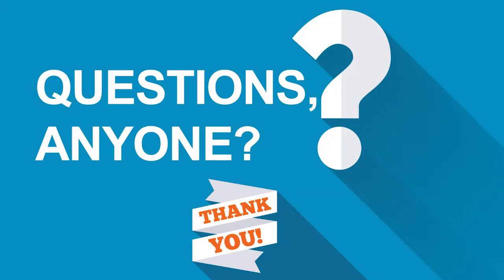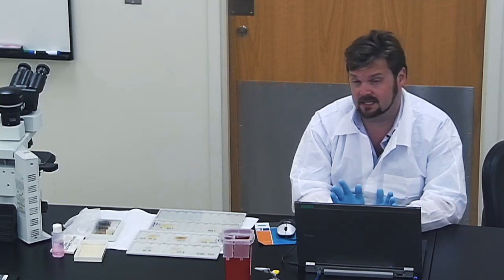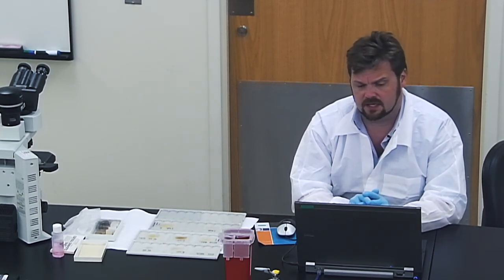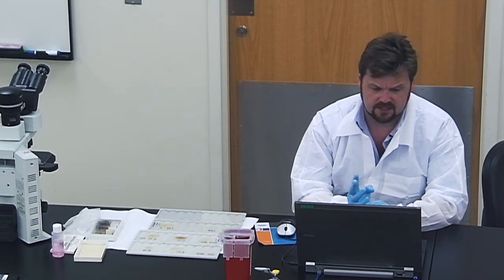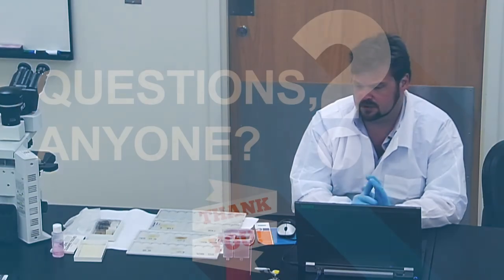Fixative, we use PVA. Ecofix is not too bad as well. I like Ecofix because you can still extract for PCR. If you're going to do modified iron hematoxylin, you really want to use sodium acetate formalin, but as soon as you hit something with formalin, you cannot get DNA out for PCR. It'll cross-link the DNA, and that's a pain in the neck these days because we always like to confirm with PCR if it's something unusual. So I would highly advise Ecofix or PVA. I really like Ecofix, but there are lots of fixatives out there. Any of the fixatives that preserve DNA are good now.